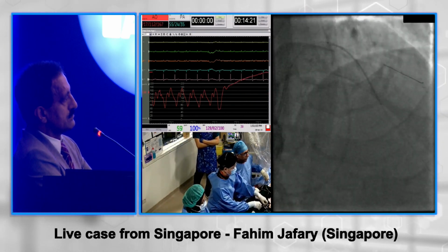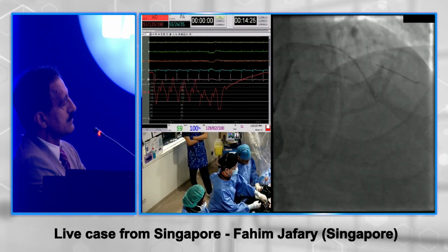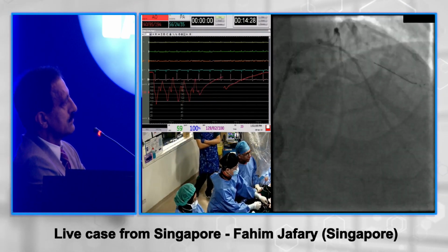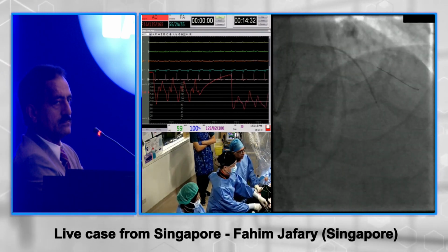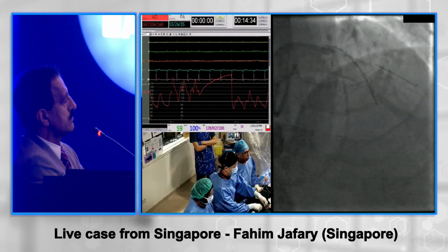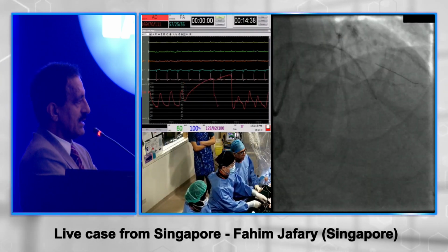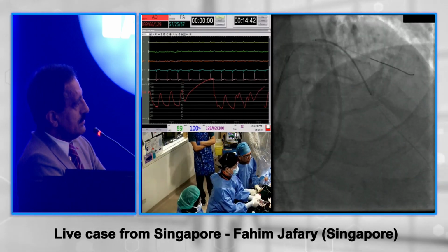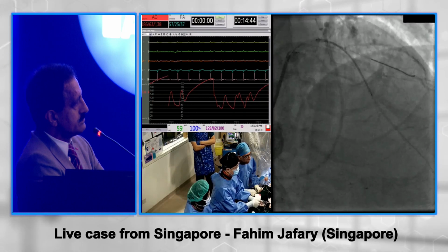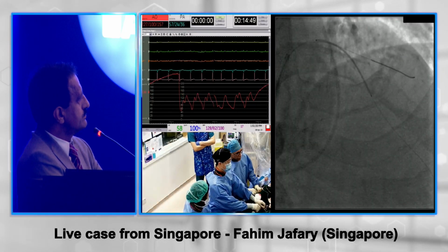Test, please. One thing we have to be careful about is that distally there's a little bit of a myocardial bridge. And so we kind of have to be a little bit in the bridge, because that's where our landing zone is. I'd like to know what the panel thinks about landing stents in a bridge when anything proximal to that is significantly diseased. So I think distally we're okay. We take a cine here. So distally we're okay, and then we come in the caudal view to take a look. So we're pretty well landed there. Come AP caudal, please. Yeah, looks okay. We have to go in a little bit, so we'll just place it.